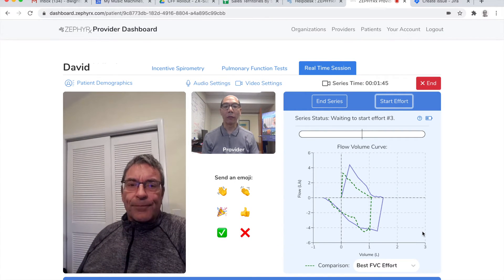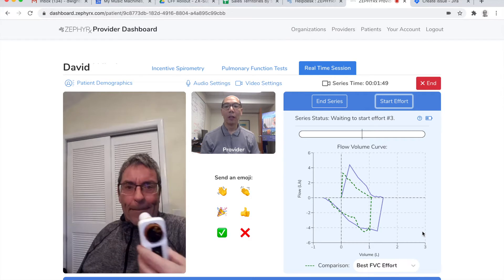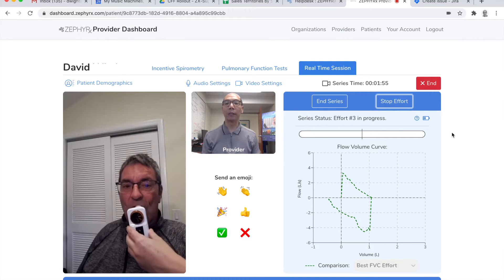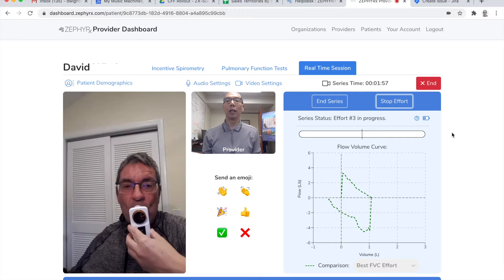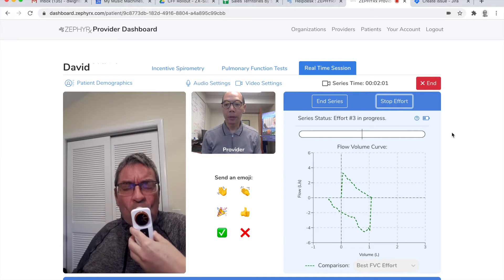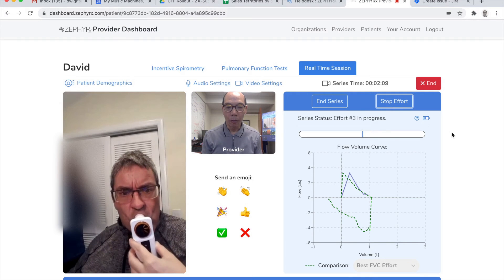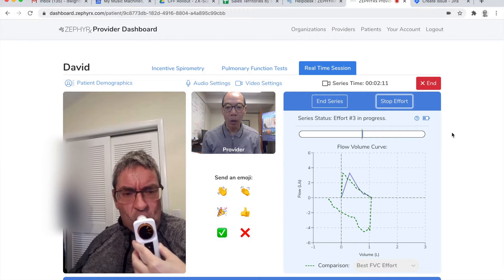Let's do one more to finish off the series. Okay. So when you're ready, go ahead and take as big an inhale as you can. And then when you're ready, blow it all out. That's great. Blow it, keep on blowing, keep on blowing.